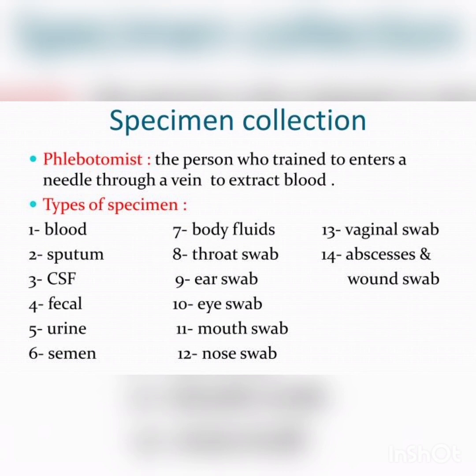So it will maintain the favorable pH to maintain the specimen for a long period of time.